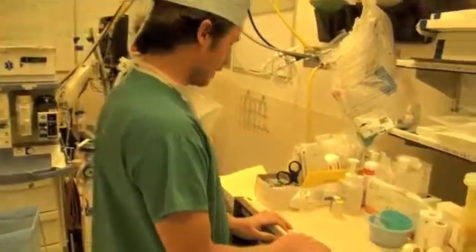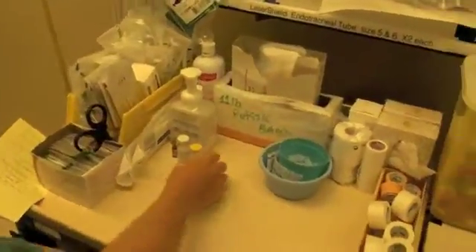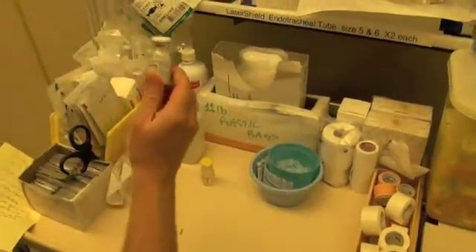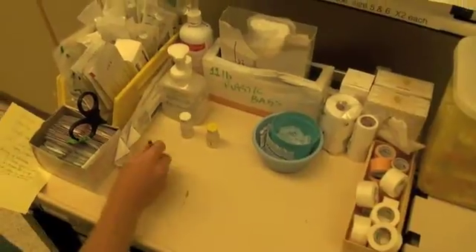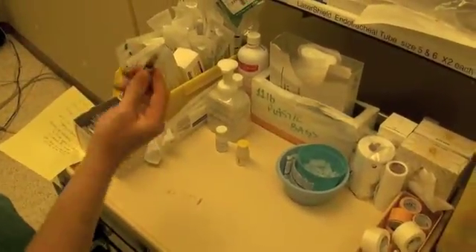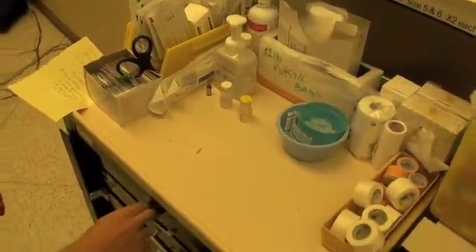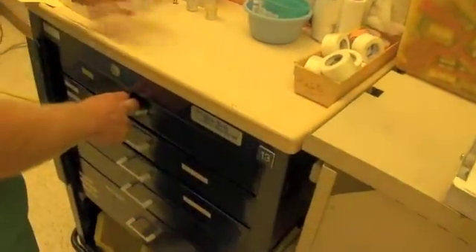We've got a workspace here on top of the anesthetic cart. We're going to be demonstrating three techniques today. One is drawing something straight up into a syringe, then we're going to use that to dissolve a powdered antibiotic, and the third technique will be diluting a medication — in this case ephedrine — 1 in 10 into normal saline. Let's get started by getting together all our materials. We've got our solutions and antibiotics there.